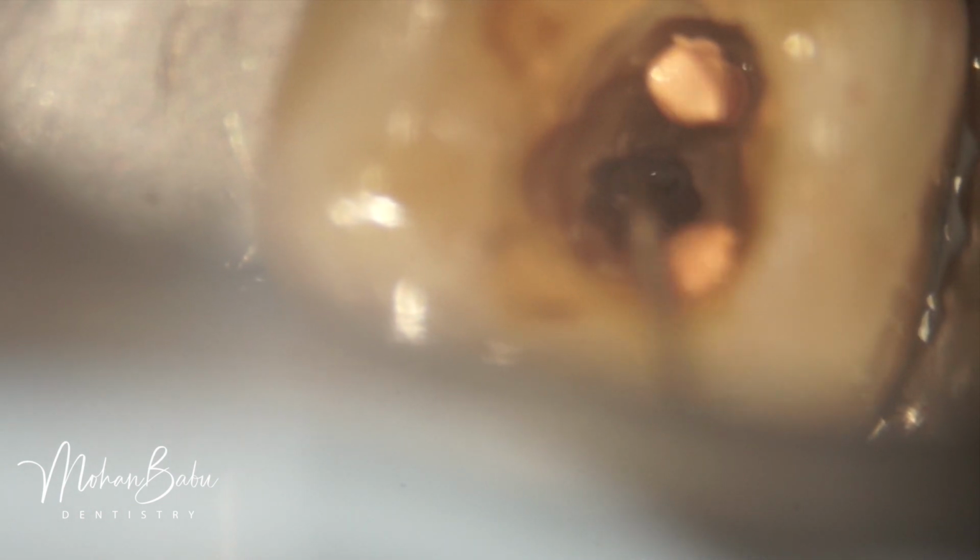And we have been successful in retrieving this instrument. In this case, we used ultrasonic files, that is U files, to retrieve it. Firstly, we enlarged the portion of the canal which is coronal to the fractured instrument a little larger, and then we made the file visible first.